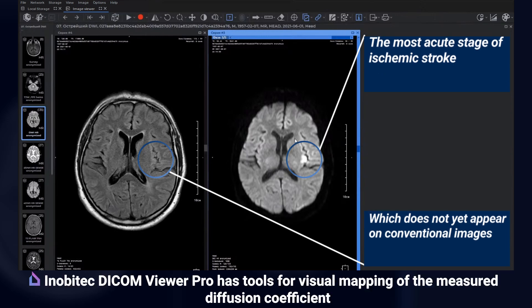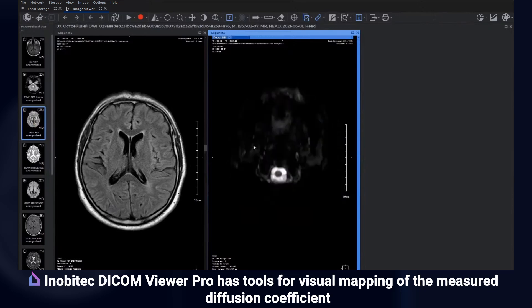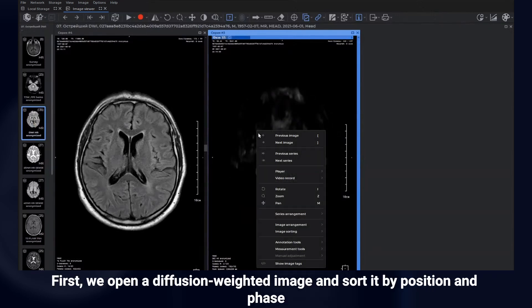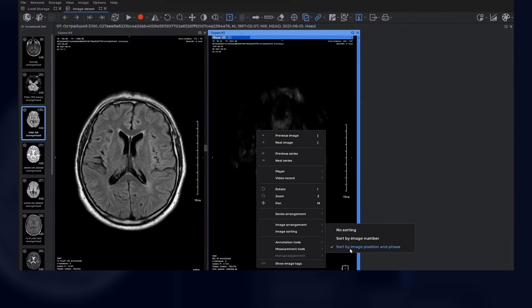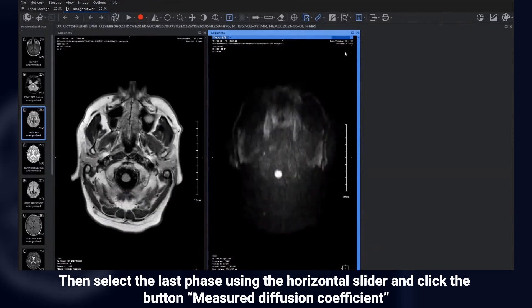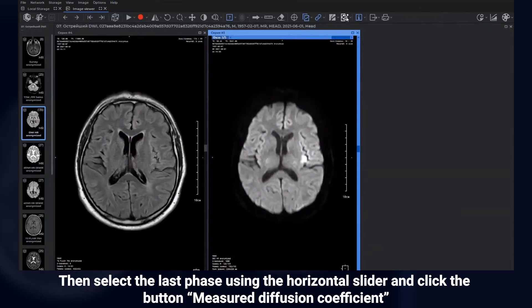Inabetech DICOM Viewer Pro has tools for visual mapping of the measured diffusion coefficient. First, we open a diffusion-weighted image and sort it by position and phase. Go to the image sorting menu and select sort by image position and phase. Then select the last phase using the horizontal slider and click the button 'Measure Diffusion Coefficient'.